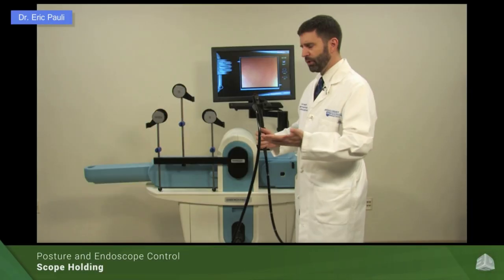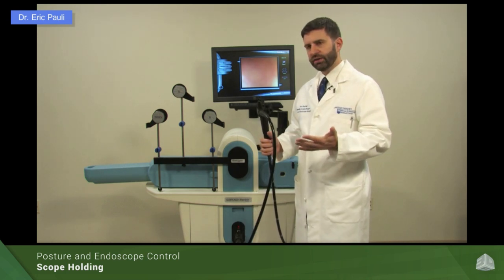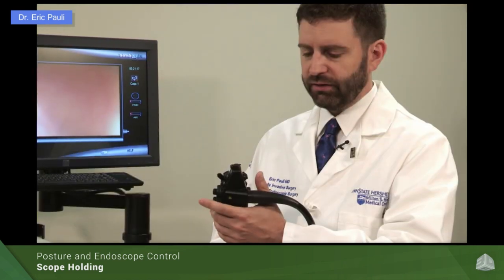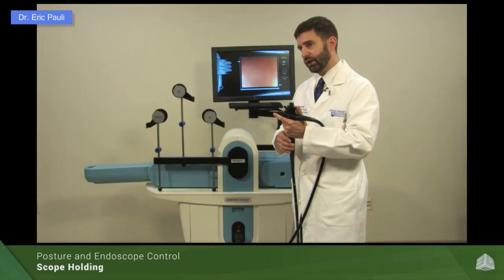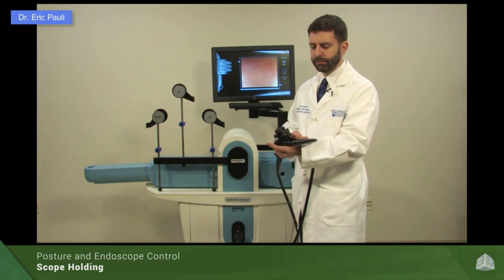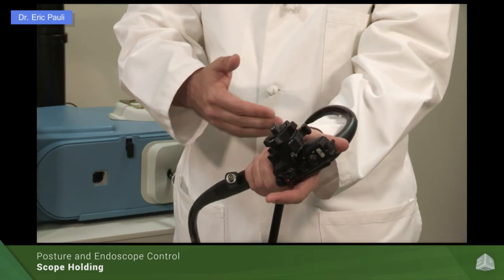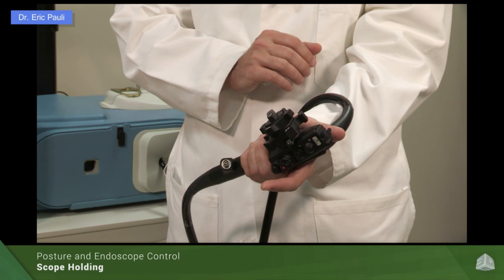We'll start with posture and positioning and how to hold the scope. For the most part, we want to have a firm, upright posture. Regardless of your handedness, whether you're right-handed or left-handed, the scope itself goes into your left hand. There are alternate ways to hold the scope — some people do hold it in their right hand — but the vast majority of people will hold the scope in their left hand. I like to have the umbilical cable on the inside part of my wrist. This is the most comfortable way for me to hold the scope.